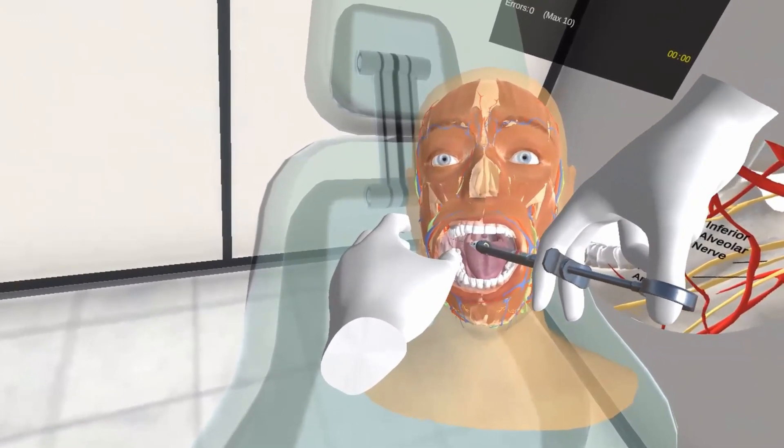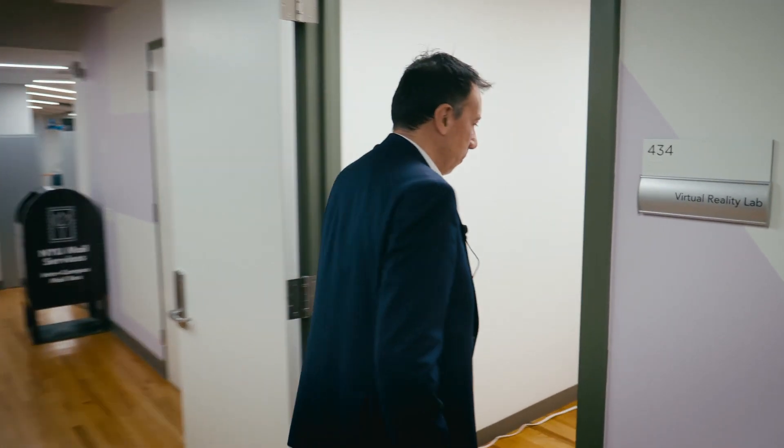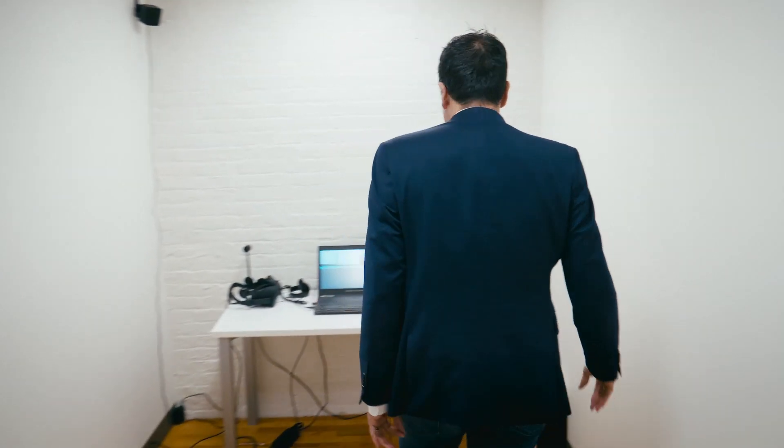On a virtual patient. If you come with me, I can show you. This space is set up for us to do the full simulation of an inferior alveolar nerve block on 230 from beginning to end.